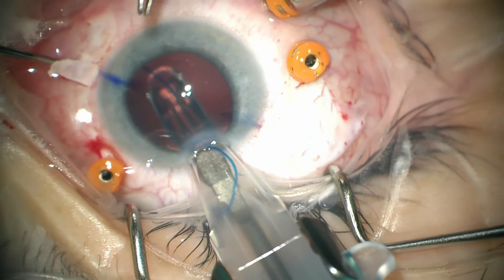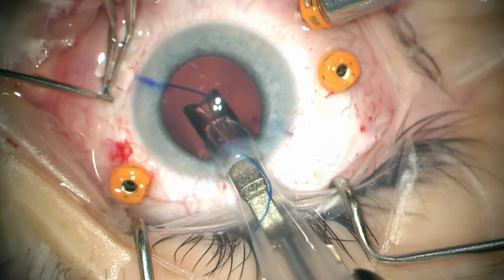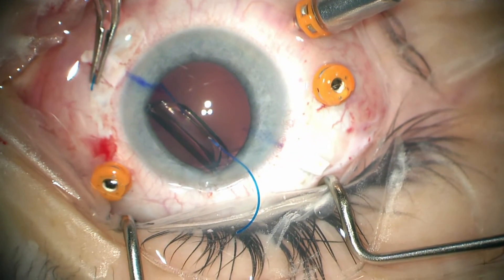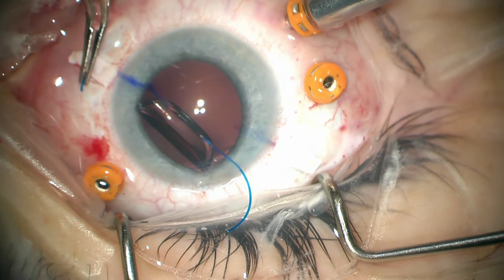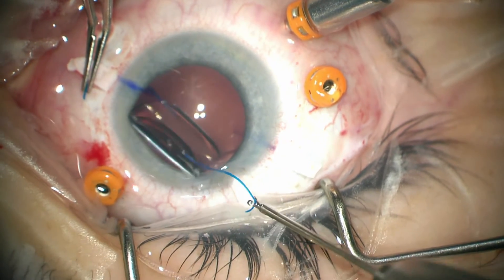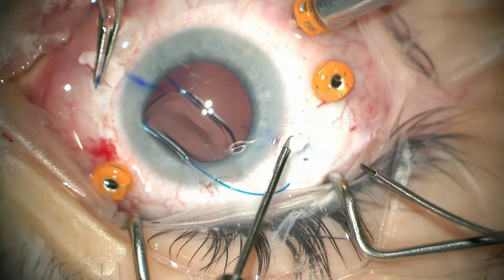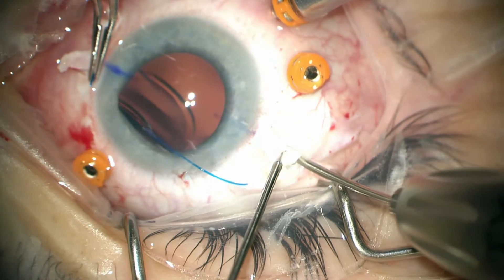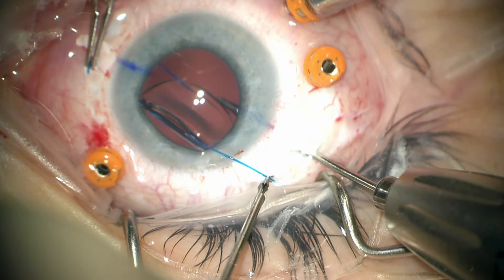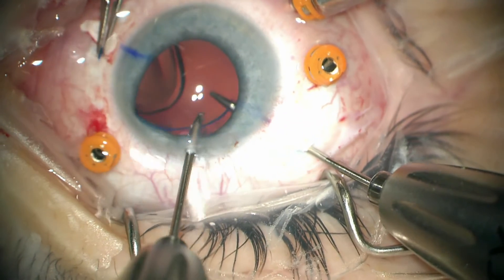So now, once we've confirmed that the leading haptic has been externalized, we can rotate the lens into the eye, leaving that trailing haptic outside of the eye. Dr. Shaw is now holding the inferior haptic, and that leaves me free to use two Duet forceps to flip over the superior haptic and then go ahead and put it into the eye. It's important to have your infusion going here as it is tough to get in and out of the eye if it becomes soft. So now we can grasp the externalized haptic and go ahead and put it into the eye and hand it off to the awaiting pair of Duet forceps.